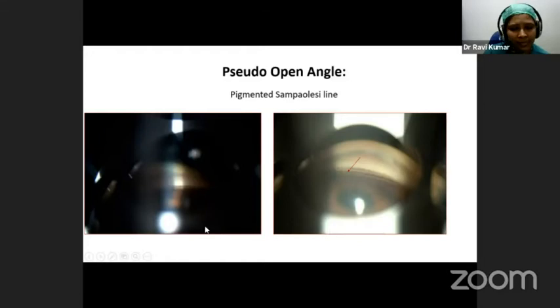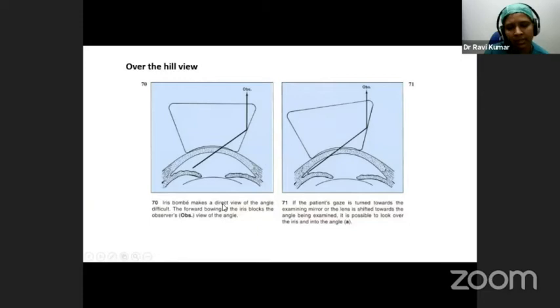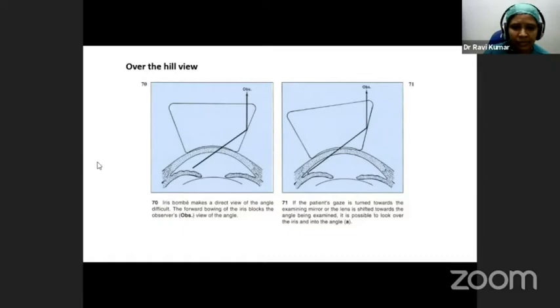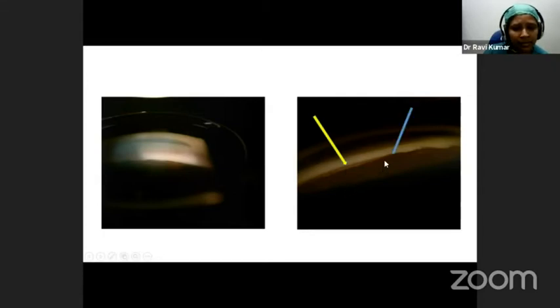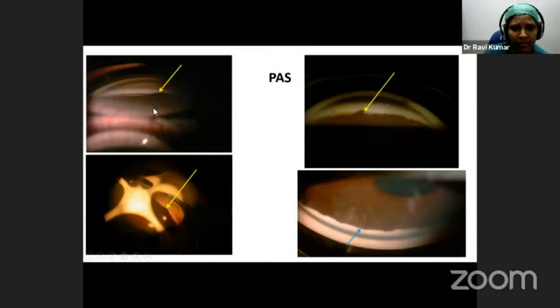If we don't have an indentation gonioscope and are using a three-mirror or single-mirror Goldmann lens, we can do manipulative gonioscopy to see the over-the-hill view: ask the patient to look into the mirror, or shift the lens toward the angle we want to see, to look over the iris and into the angle. In an example, the angle appears completely closed with no angle structures visible, but indentation shows some parts open to the scleral spur, while the temporal part does not open — indicating areas closed by peripheral anterior synechiae.